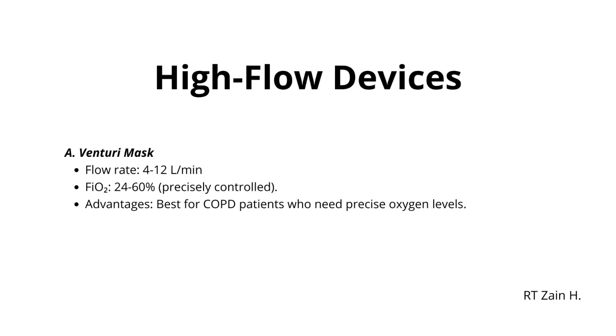High-flow devices. A. Venturi mask. Flow rate, 4 to 12 liters per minute. FiO2, 24 to 60%, precisely controlled. Advantages: best for COPD patients who need precise oxygen levels.